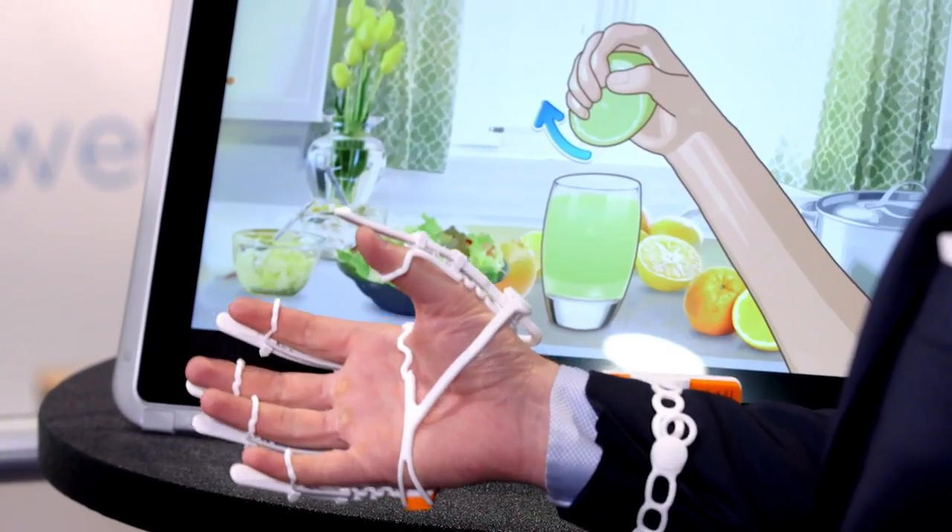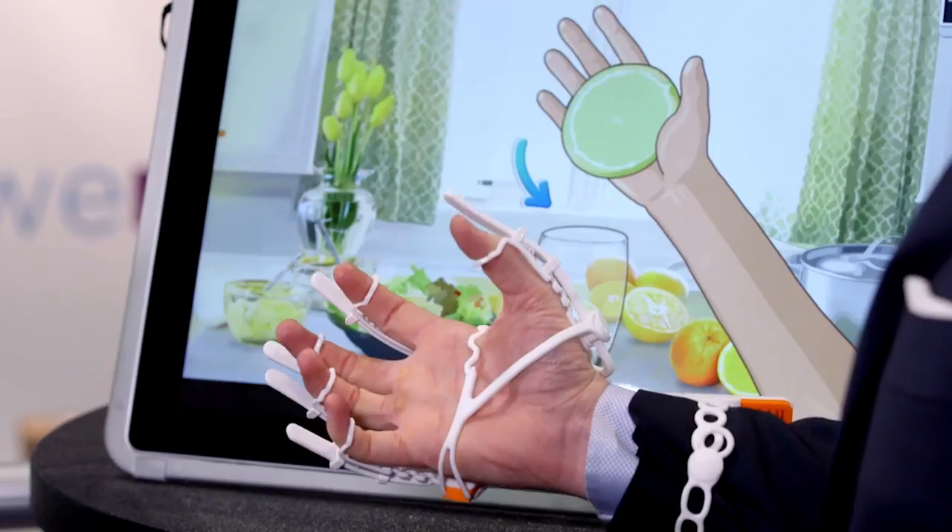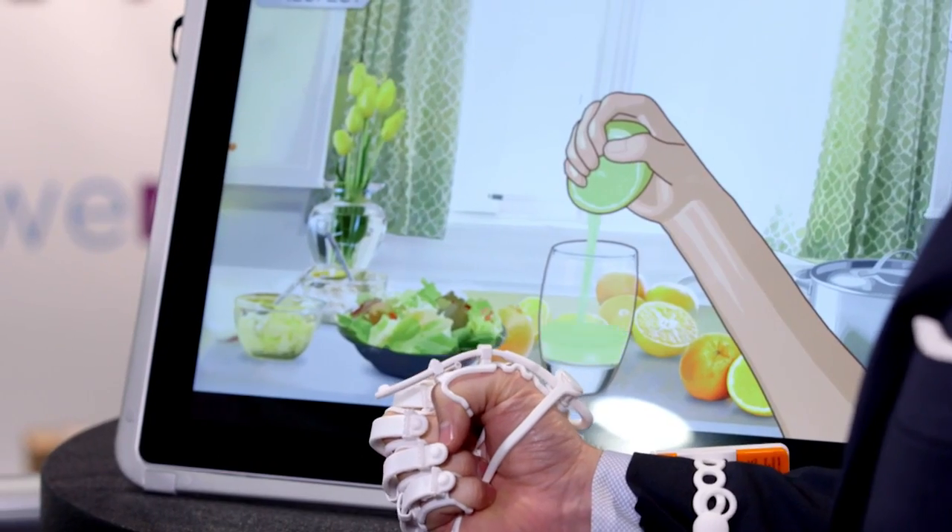So like squeezing a lemon? Exactly. So right now these sensors are just reading how much I'm clenching. So I clench and it's seeing if I'm doing a good job or a bad job.